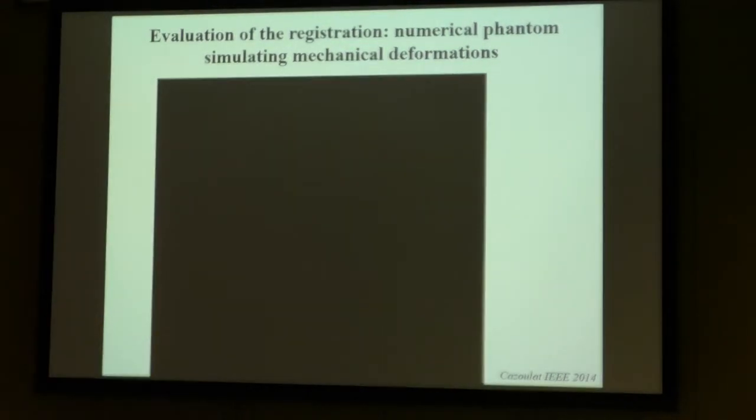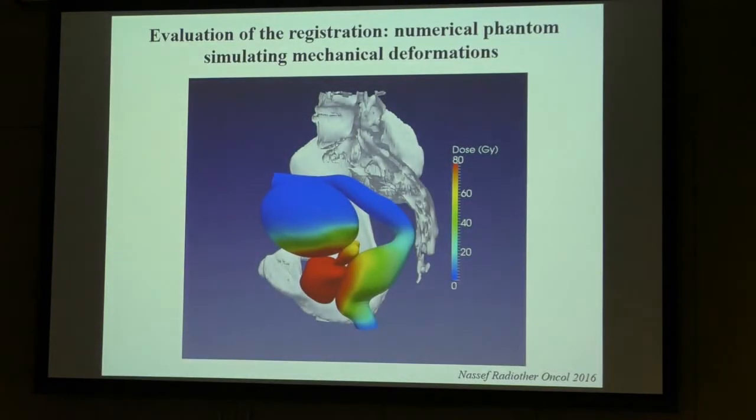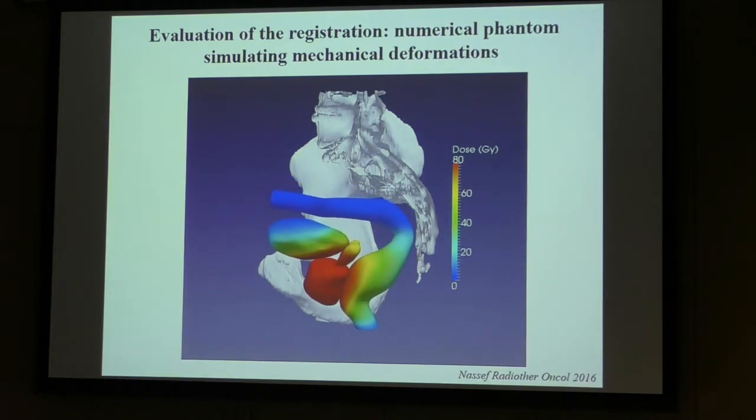This is a way to consider the accuracy of the dose propagation by using an elastic registration method. I don't know if I am clear or not.